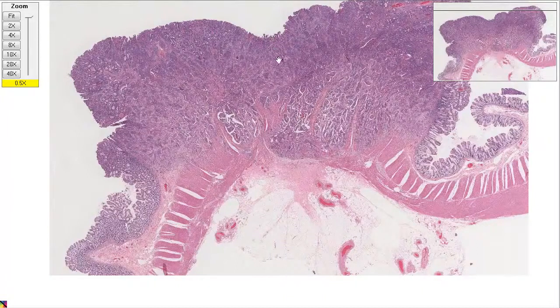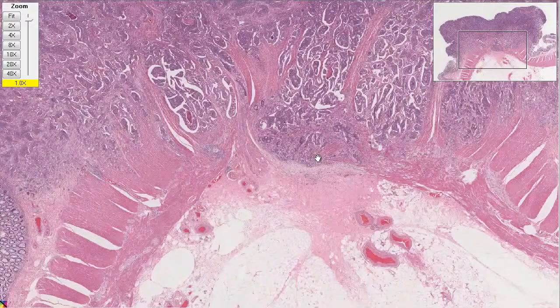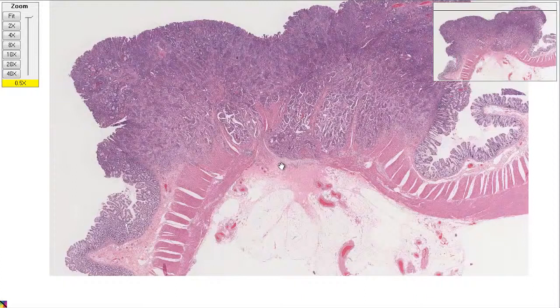And then if you begin to just cross over like here and invade, then you're to stage 1. And then there are depths as you go for stages. And then there's always the other thing: did it go off to other parts of your body? Did it get to the blood vessels? That's the highest stage. And this is true of all cancers. When people talk about breast cancer, I've heard it in that context a lot. Stage 0 through 4, and so it isn't just the size. If the cancerous tissue is big, but it's in a safe place, it could still be stage 1 or stage 0.